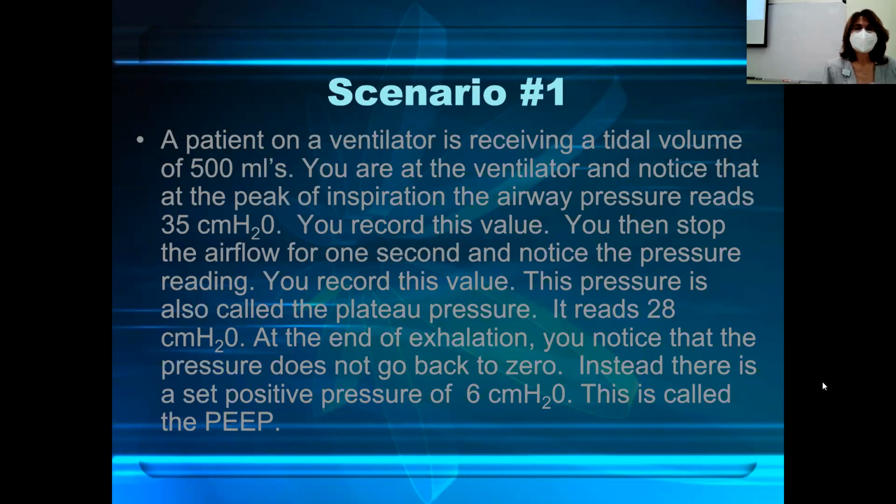Okay, so Gretchen, for the static compliance, you're going to use the plateau pressure and subtract the PEEP. That'll give you the bottom number. So plateau pressure minus PEEP.